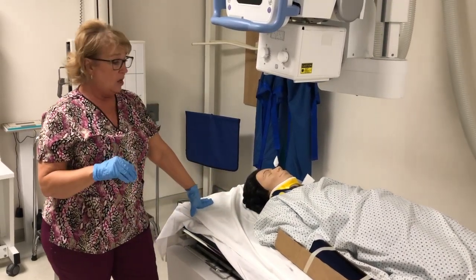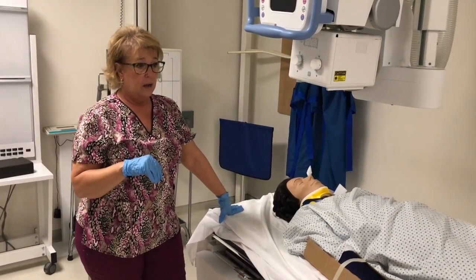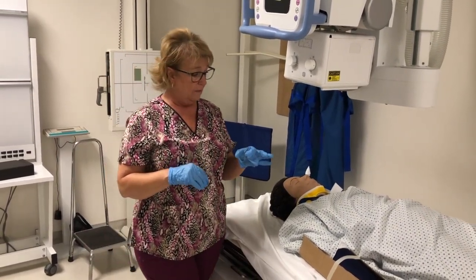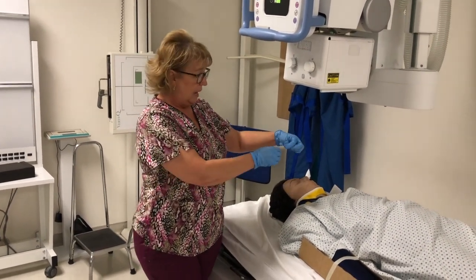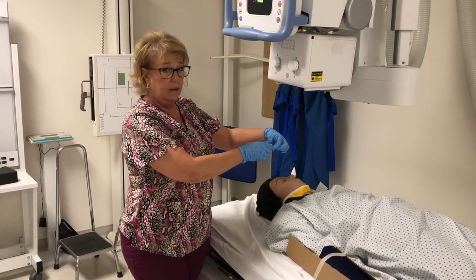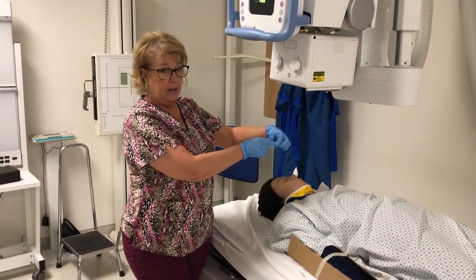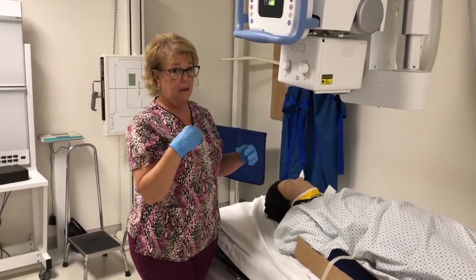If the patient can open their mouth, I would have them open their mouth. If they couldn't, some departments will have a radiolucent bite guard, and you could actually part the patient's jaw and put that bite guard in, and then take the x-ray right through the bite guard so that the teeth are out of the way.